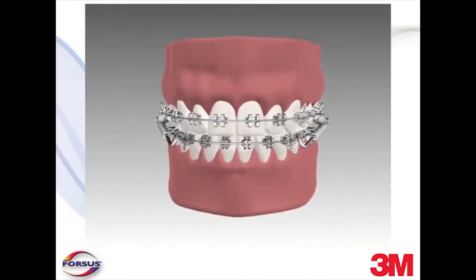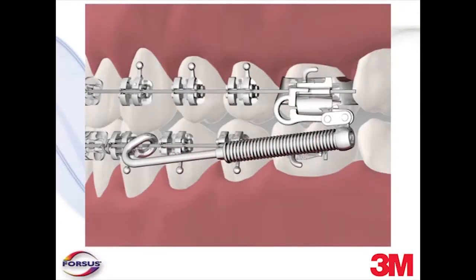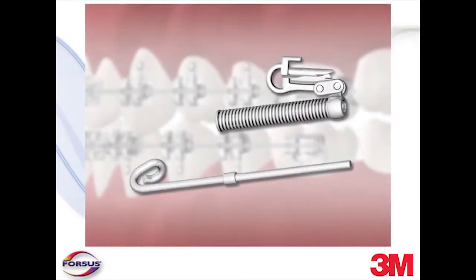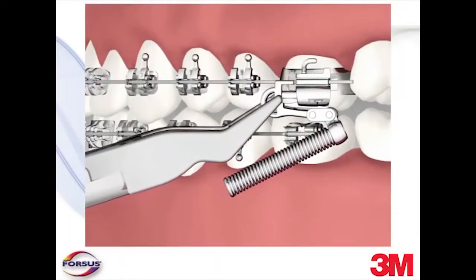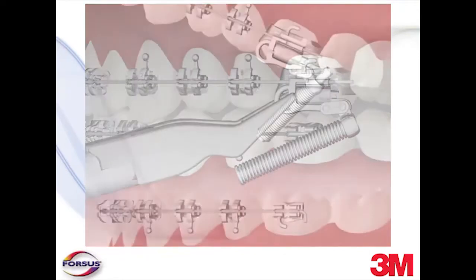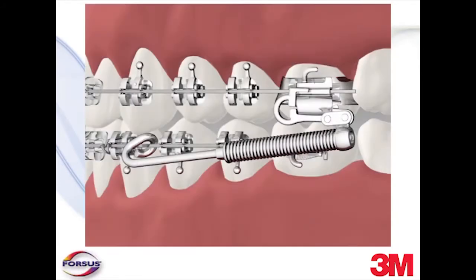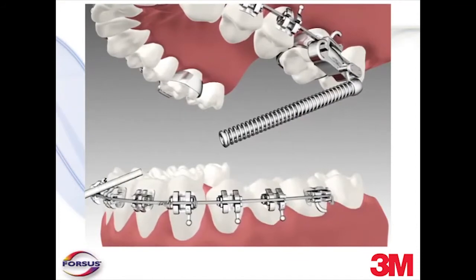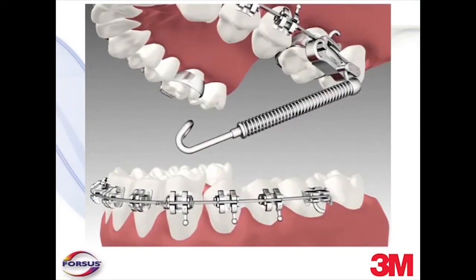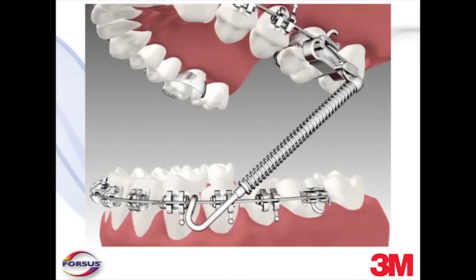The Forsus Fatigue-Resistant Device is a unique appliance designed to achieve efficient Class II correction. It is composed of two main components: a spring module and a pushrod. The spring module is attached to the upper first molars through the headgear tube, and the pushrod is crimped onto the lower arch wire. The device is engaged when the pushrod is inserted into the spring module. The spring is deflected when it rests against the built-in stop on the pushrod, creating force.